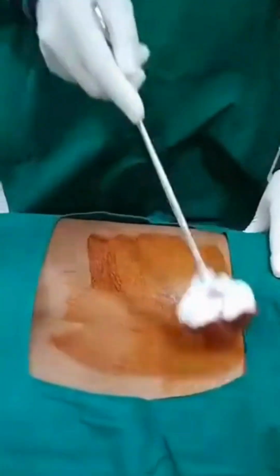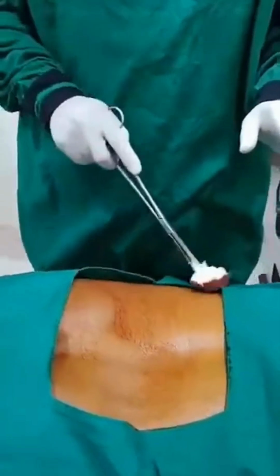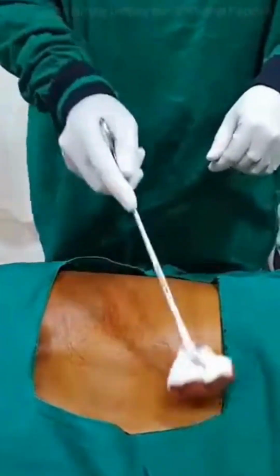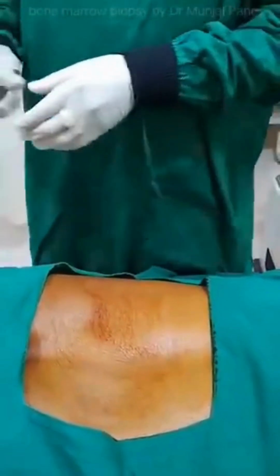We have to first take consent of the patient, and after taking the consent, we have to explain the procedure to the patient. 7,000-8,000 with a normal hemoglobin and WBC count. So my clinical diagnosis pre-bone marrow biopsy is ITP. So let's see what it comes in the ultimate diagnosis.